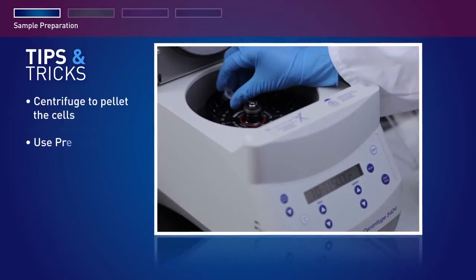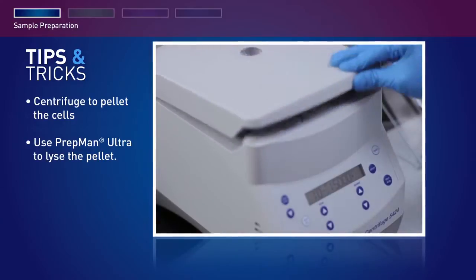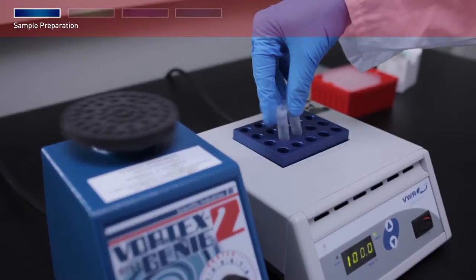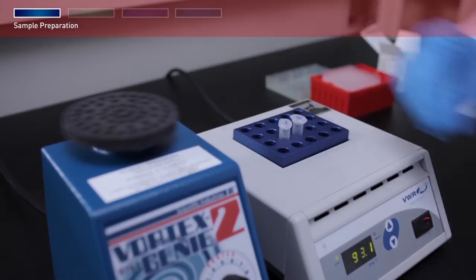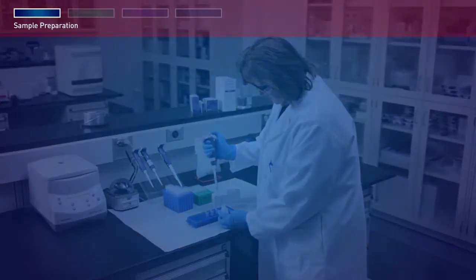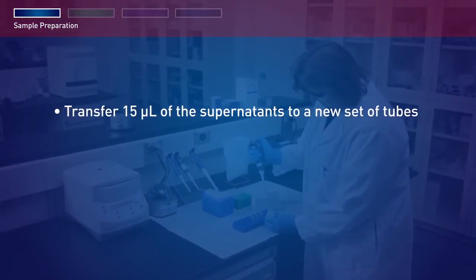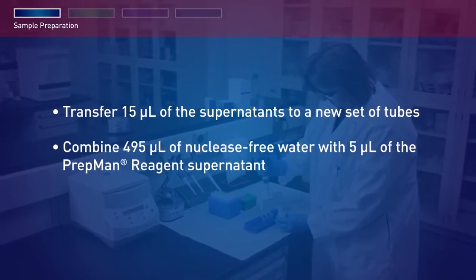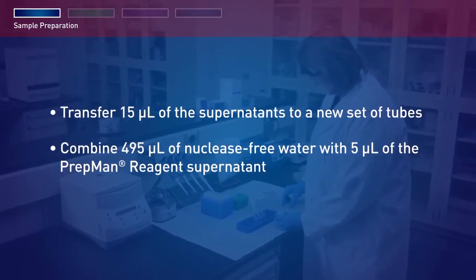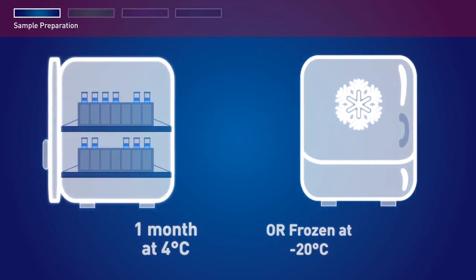Centrifuge to pellet the cells and use PrepManUltra to lyse the pellet. Re-suspend the cells in the PrepManUltra sample preparation reagent, vortex, and place in a heat block set to 95 to 100 degrees Celsius. Remove the sample tubes from the heat block. Cool and centrifuge to collect pellets. Then transfer 15 µl of the supernatants to a new set of tubes. Combine 495 µl of nuclease-free water with 5 µl of the PrepMan reagent supernatant.